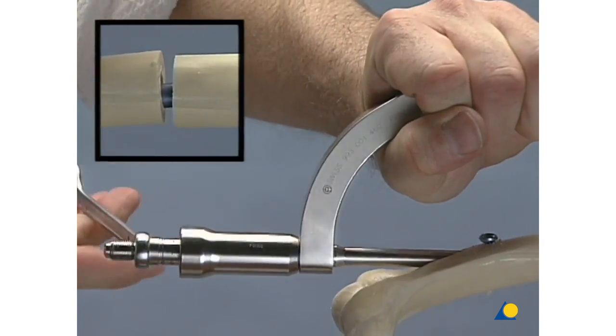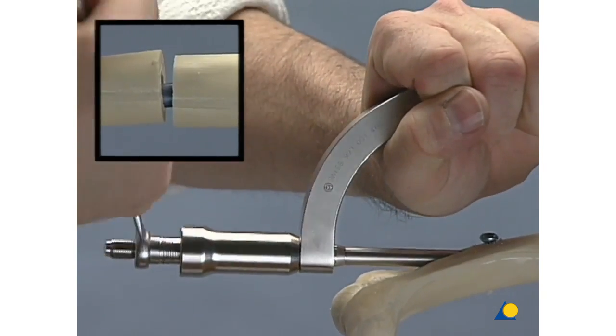Tighten the compression connecting screw and check the gap closure under the image intensifier.